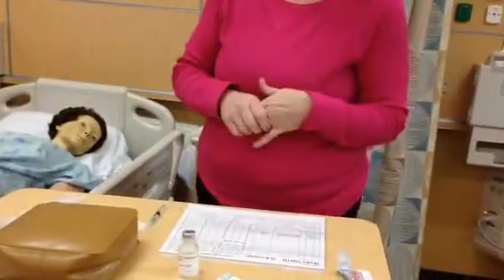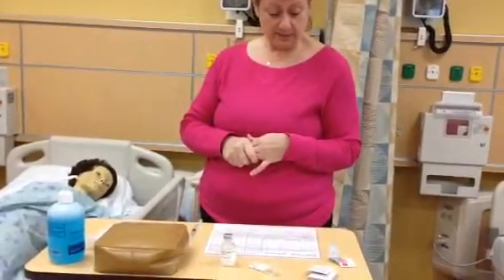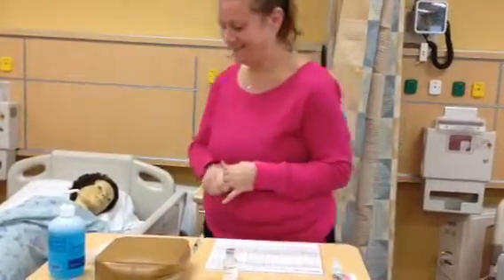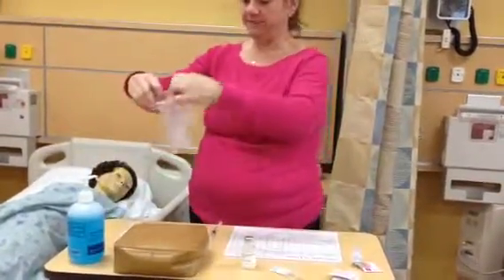So I've checked the right dose, I've checked the right patient, the right time, the right amount, medication, and patient. There's a lot. So again, I will perform hand hygiene. I will put my gloves on.